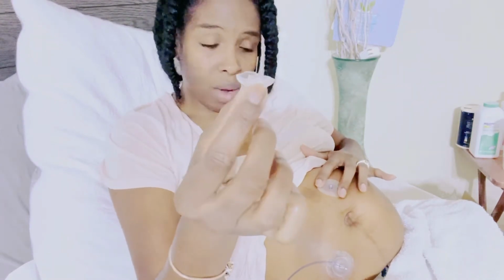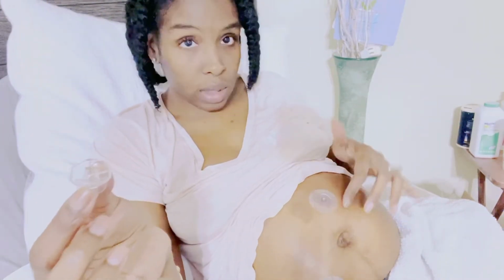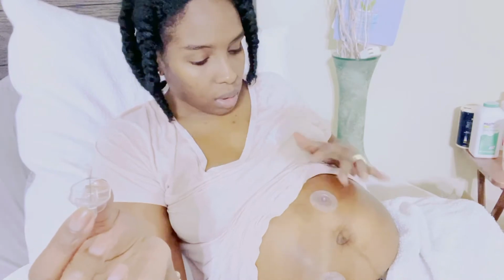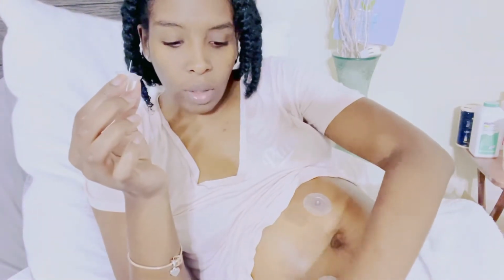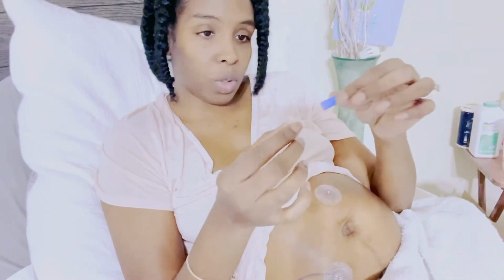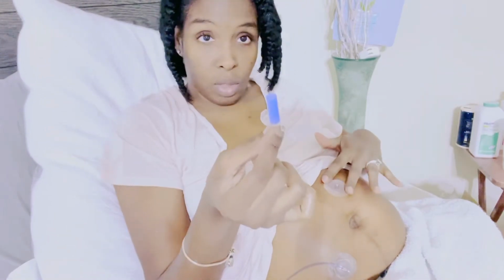See, the needle is out. See, your site is here. See, it's nice and clean and secured. Now, they have a little cap in here to recap. In the hospital, you don't really keep recap things, but outside of the hospital for home care, you get to recap for safety.